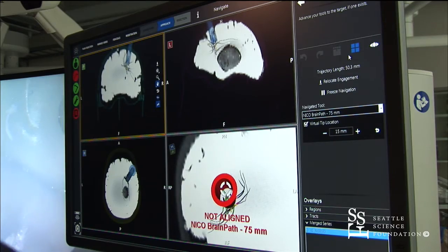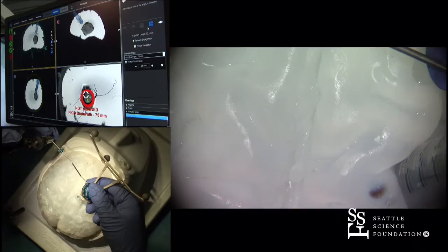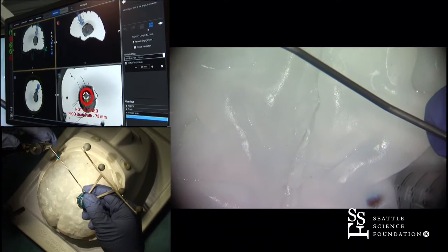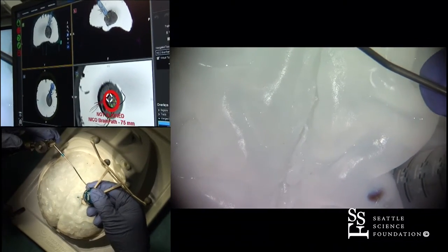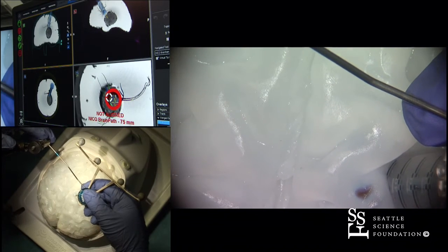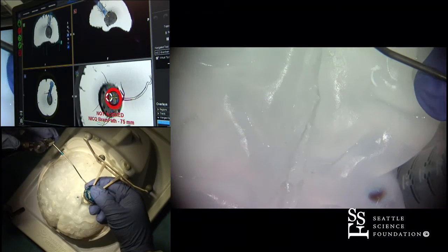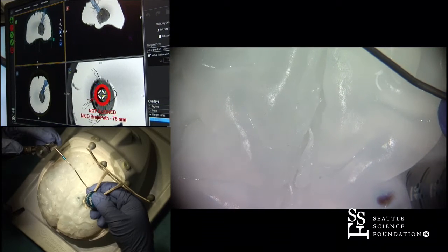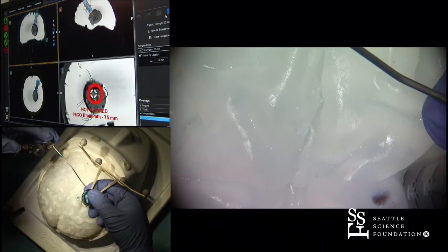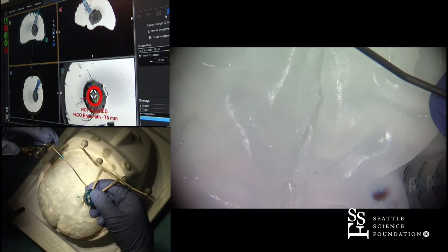I'm going to get to where my entry point is. Green is going to mean go. The thing about this system is trying to get it lined up here. This isn't my system, so it's a little bit of a challenge — it's mostly the gel model.